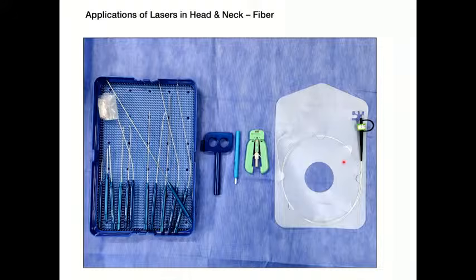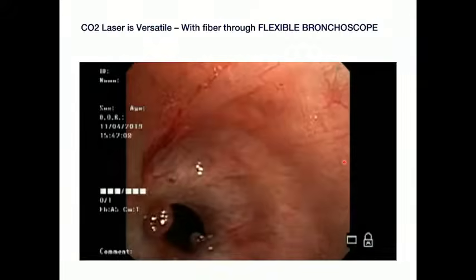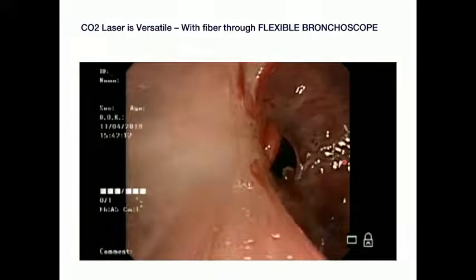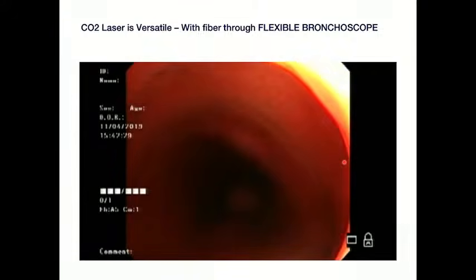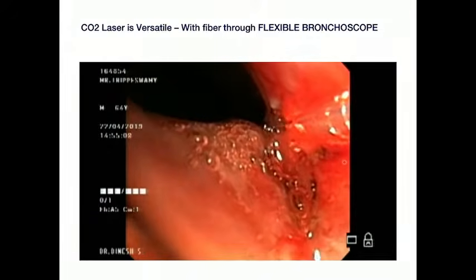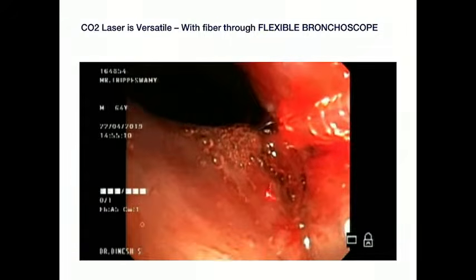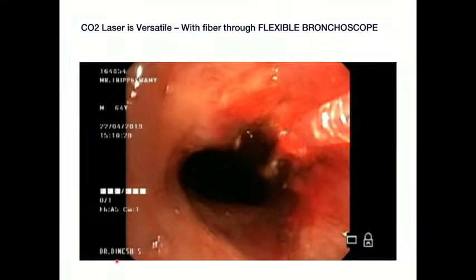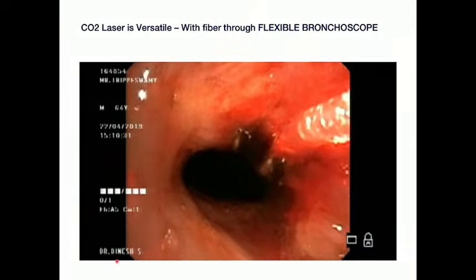Nowadays the G3 laser and newer lasers come with multiple-use laser fibers, but the one provided by Boston is good for only 5 uses and costs about 2 lakh rupees. Once you switch on this machine and plug in this fiber, it gets counted as 1 use. So you need to bill the patient, dividing the 2 lakhs by 5, and you have to use it judiciously. But if you have a fiber, it really helps in navigating and overcoming those difficult anterior commissure lesions.